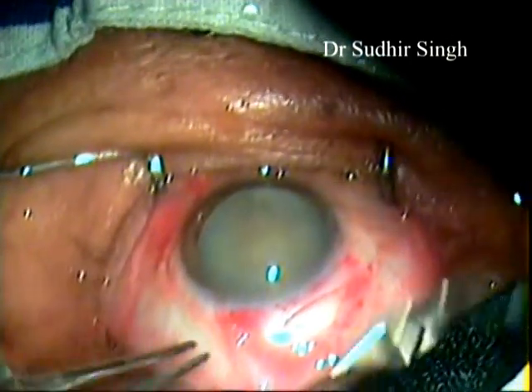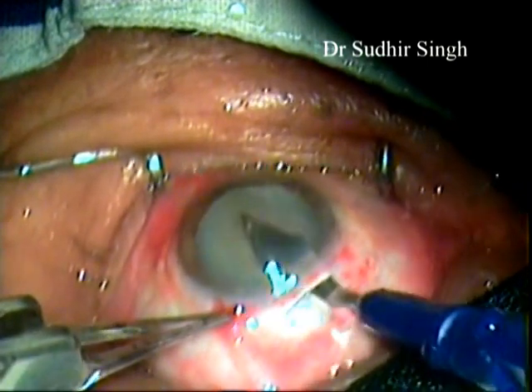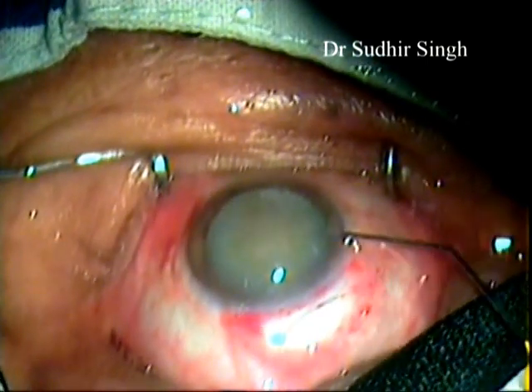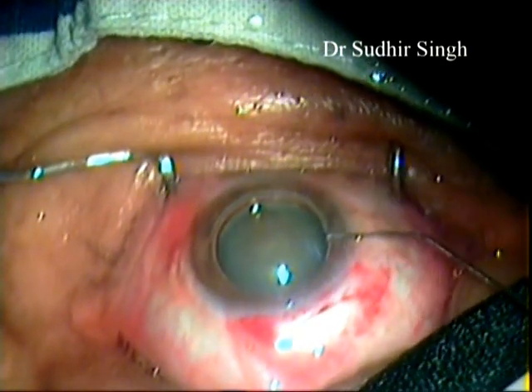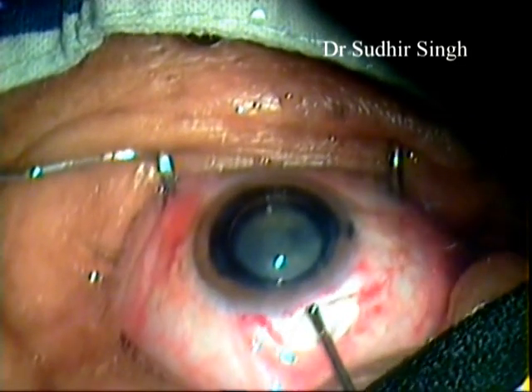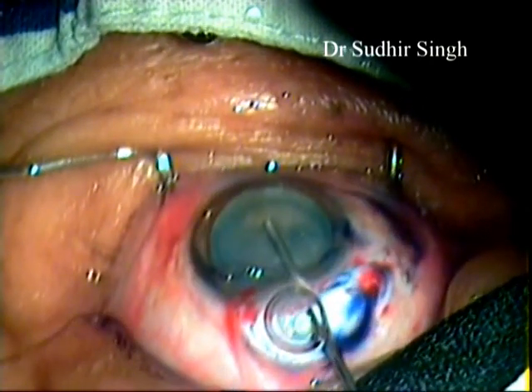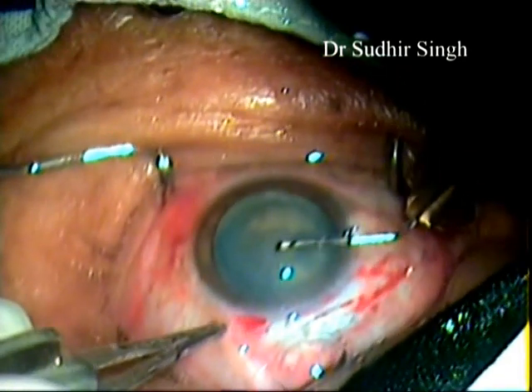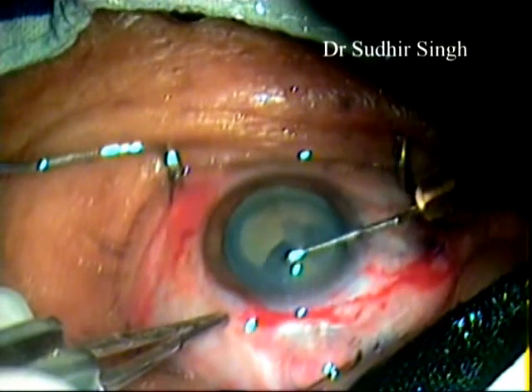Entry into the anterior chamber is made with a 3.2 mm keratome. Air is injected into the anterior chamber. Trypan blue dye is injected under the air bubble to stain the lens capsule. HPMC viscoelastic is injected into the anterior chamber and the dye and air are pushed out. Capsulorrhexis is made with a 26-gauge needle capsulorhexis.